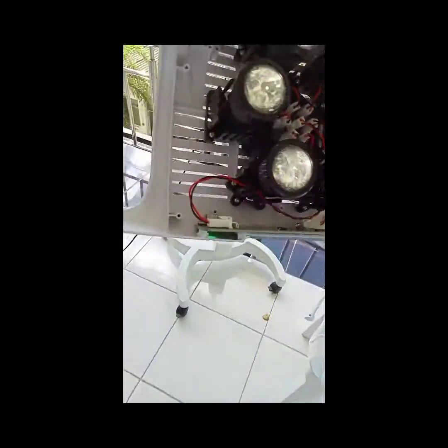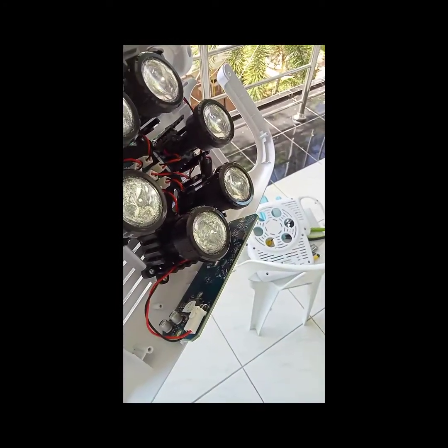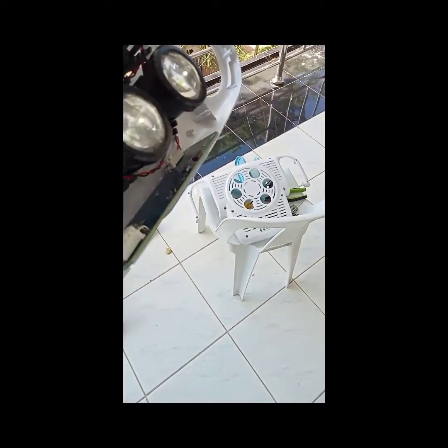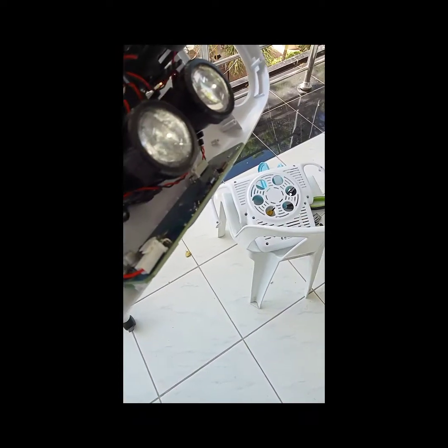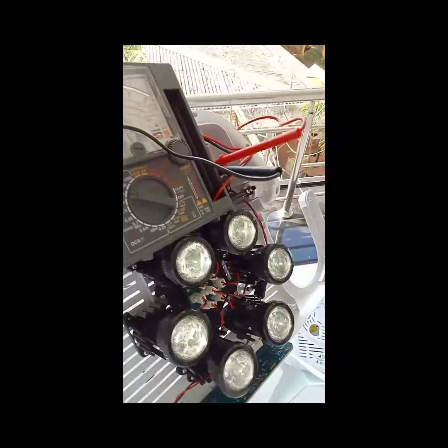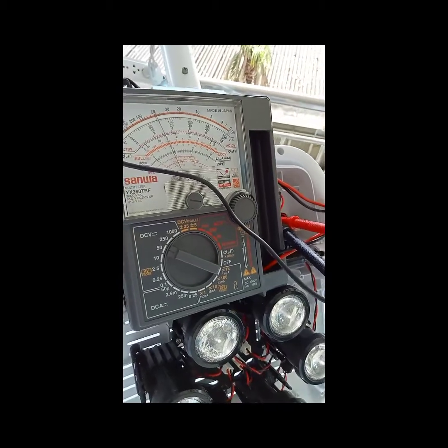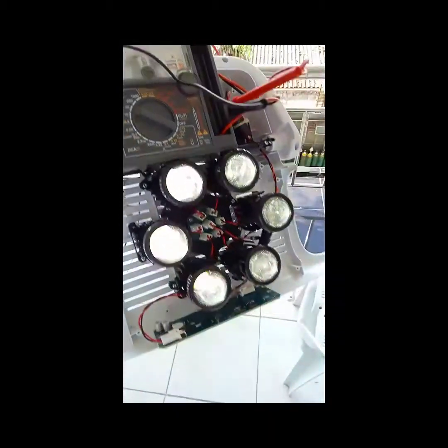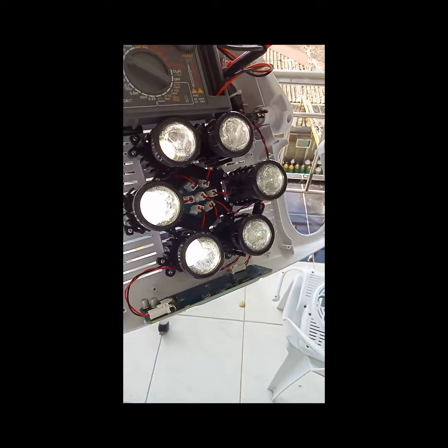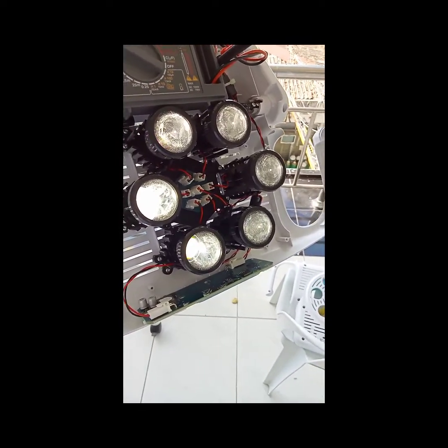The problem is when it turns on, it will turn off suddenly. So what we're going to do is check the sensor first, then the voltage. I already did test the voltage and it is at 15 volts output. As you can see here the light is on and I'm going to monitor this one to see if it does turn off by itself.